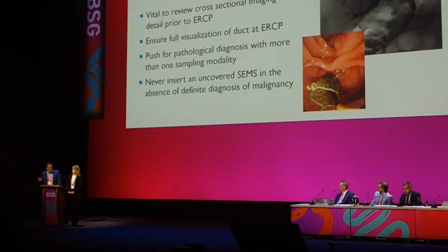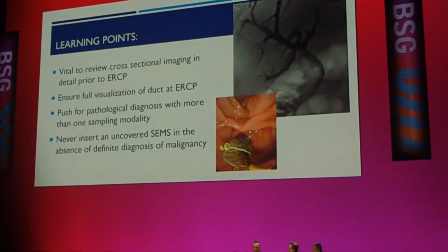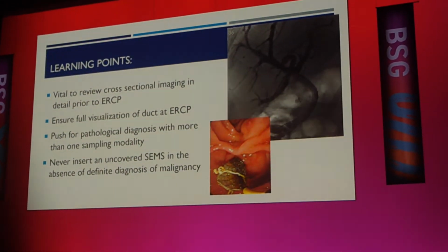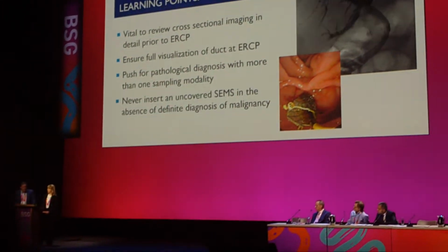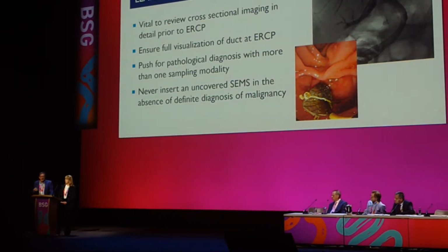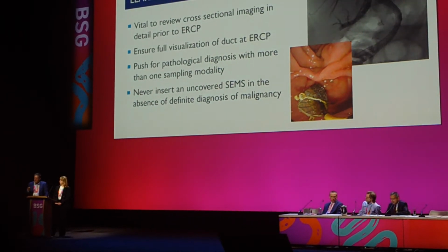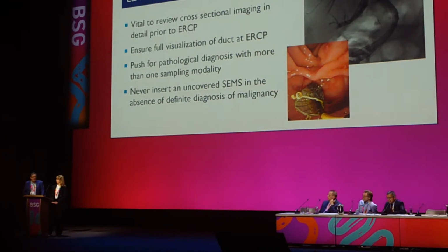And the promise of cholangioscopically directed biopsies is not actually as great as clinical experience would suggest. Certainly with regards to visual diagnosis, the visual quality of cholangioscopy has got brilliant, and we assumed that just as with colonoscopy, all of us can now see a cancer of the colon and say this is a cancer of the colon.